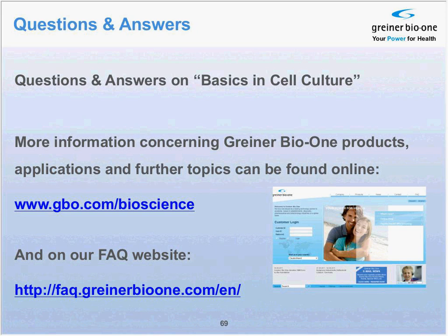Now the next question was pros and cons of filtering media. Personally, I've never filtered media. You should have the appropriate safety measures, and what should be filtered with the media, or if you use serum, mycoplasma would pass the filter, and the ingredients that you receive should also be sterile. So for sure it wouldn't do any harm, the filtering process, as long as it is done in sterile conditions, but in my opinion it's not really necessary.